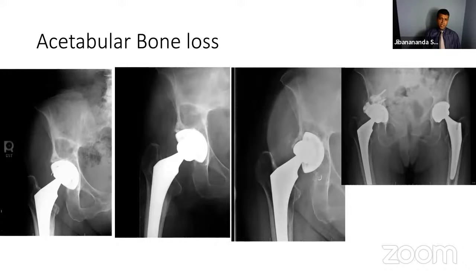I think it was done in 98 or 99, something like that. When my ex-partner revised this with a liner exchange, something to be very careful about when you have such significant bone loss is that it may not be very well supported. And as it happened, it collapsed into the hole. So maybe the way to do this is to open a window on the bone laterally and pack bone graft. It's very difficult to graft this entire hole through the holes in the cup.